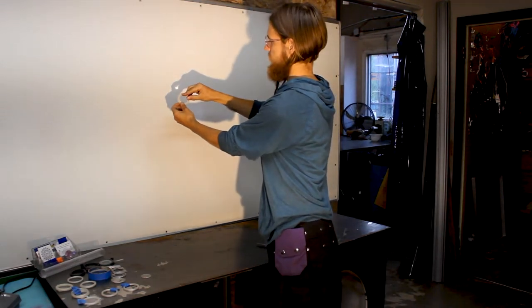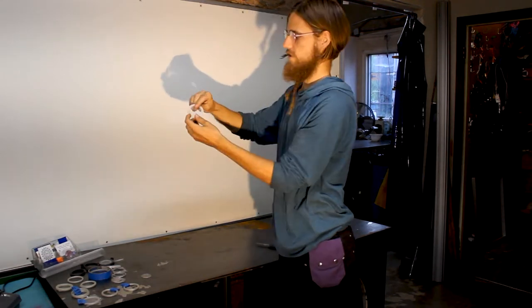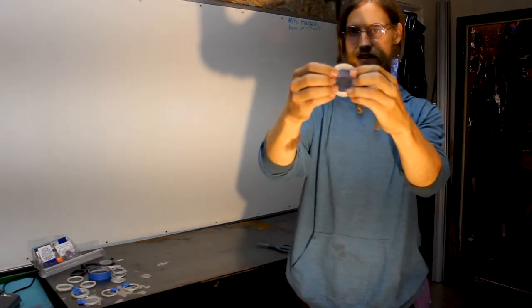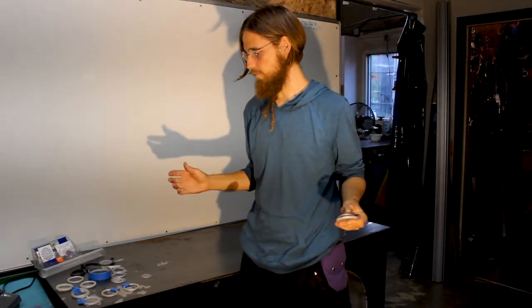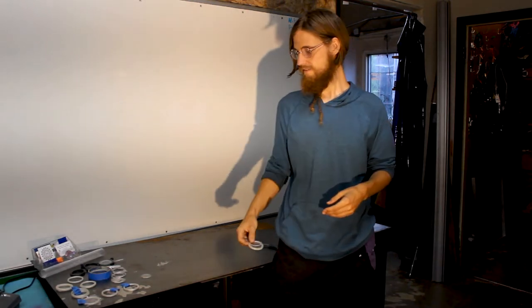Like you can see on the board here, it's definitely changing the focal length. I'm not sure how much you can see that on me, but I'll do more videos on that. But I just 3D printed the latest prototype, and I'm gonna walk you through making it.